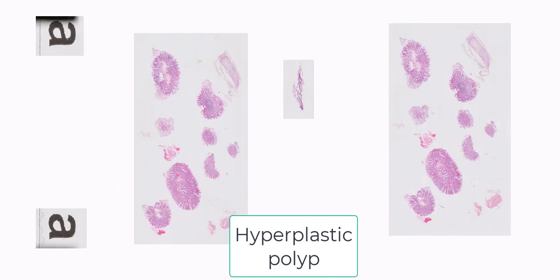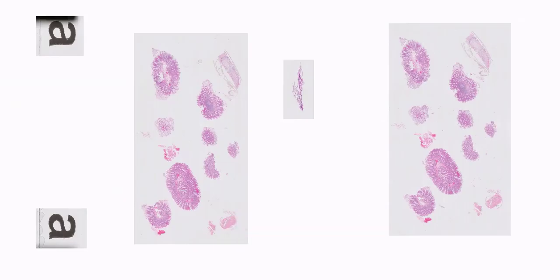This is the most common polyp in the colon: a hyperplastic polyp. Even the humble hyperplastic polyp can occasionally pose a question. Let's go over the classic histologic features of a hyperplastic polyp and then address the specific question being posed by this polyp.